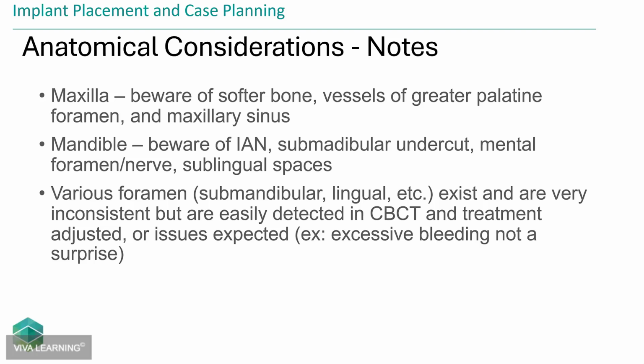And if I had to say some of the rules that I've really learned to live by, it's that for anterior crowns, being placed too far facial is a death sentence. The worst cases I've ever had to manage, that usually came to me because of complications, are where an implant in the anterior maxilla was placed too far facially, leading to almost no good outcome for a restoration.